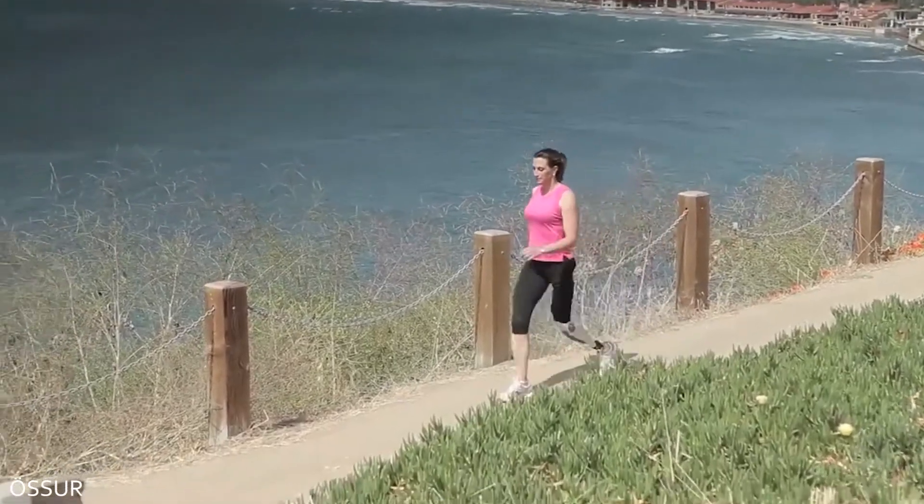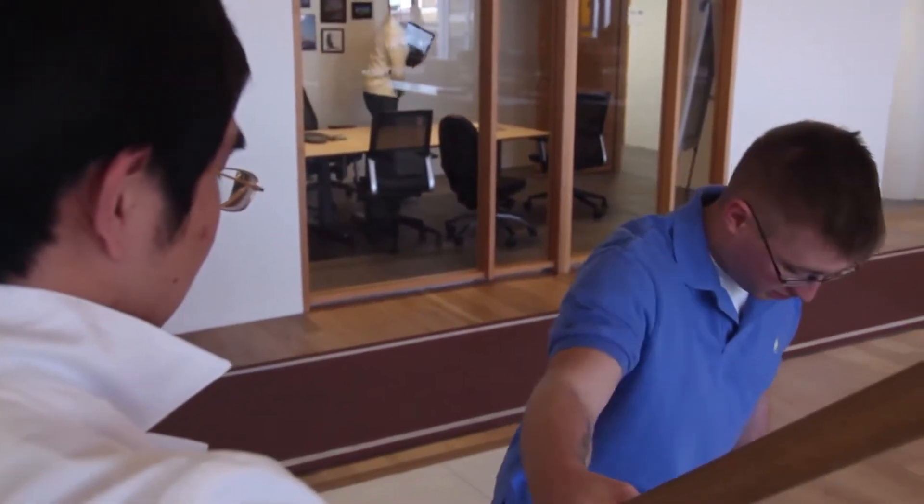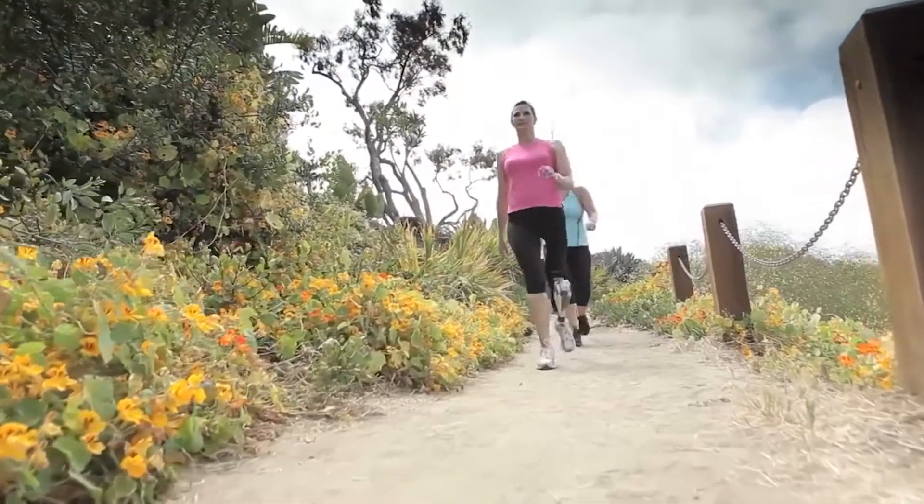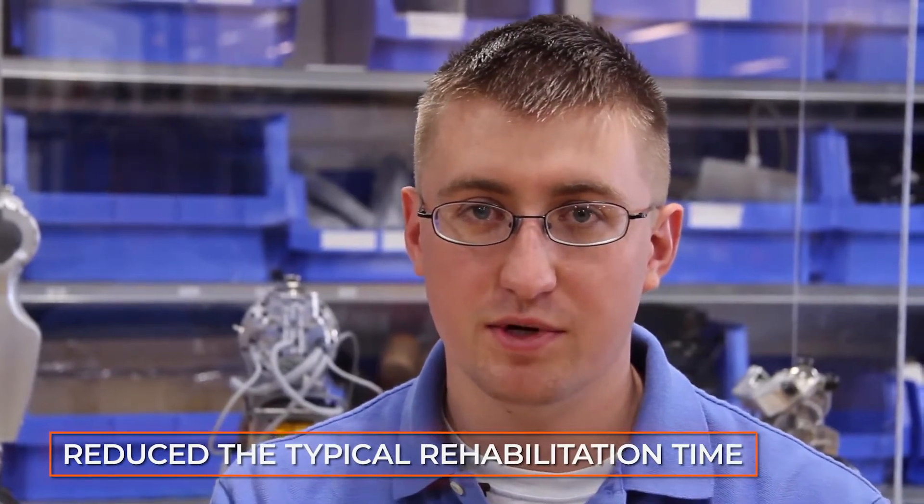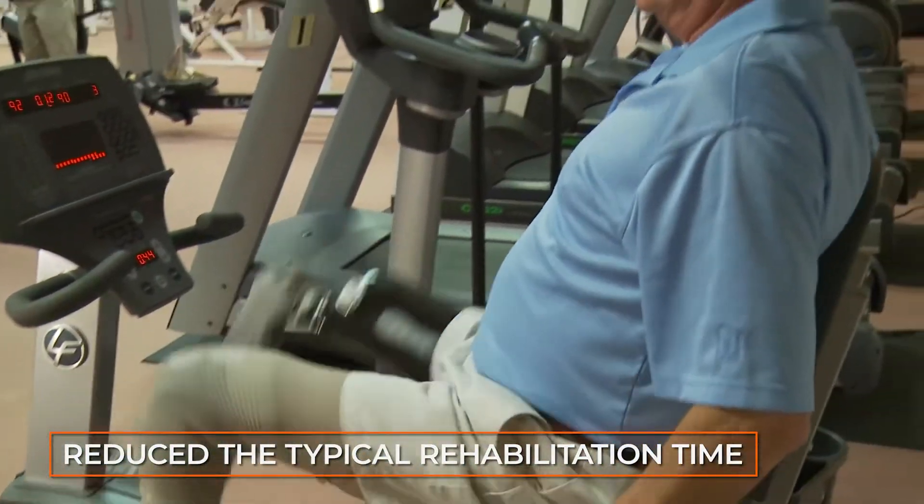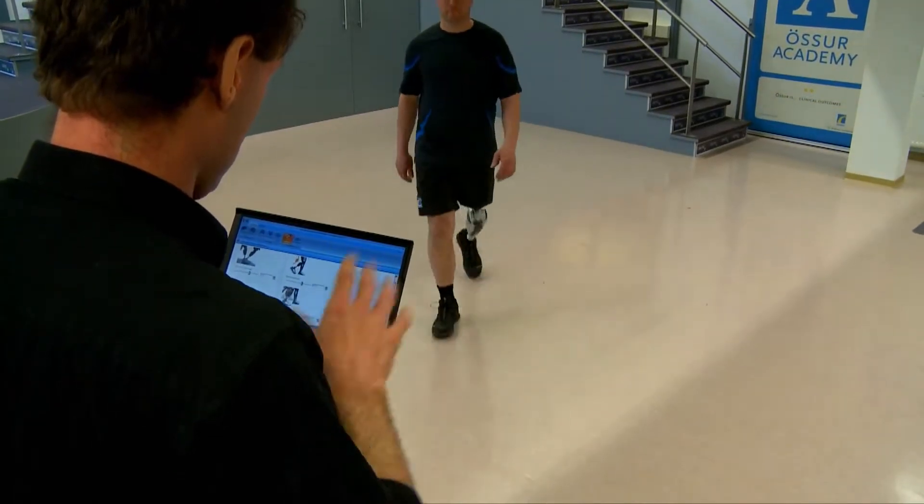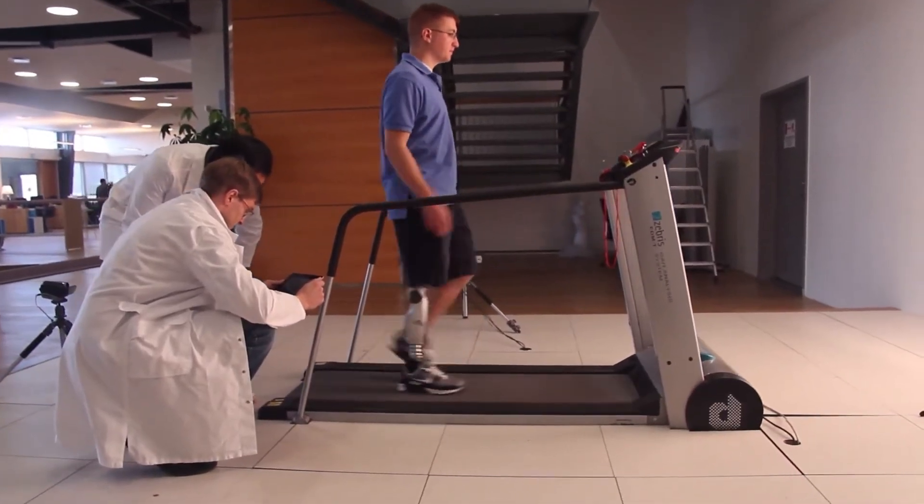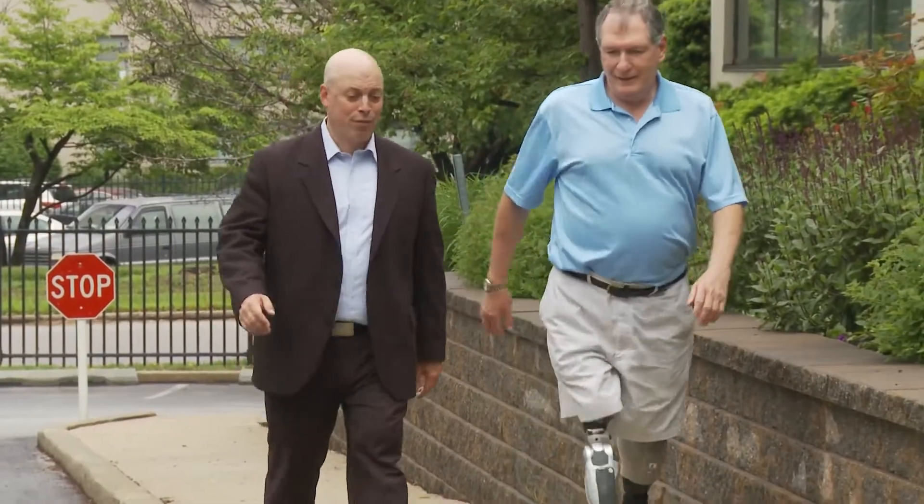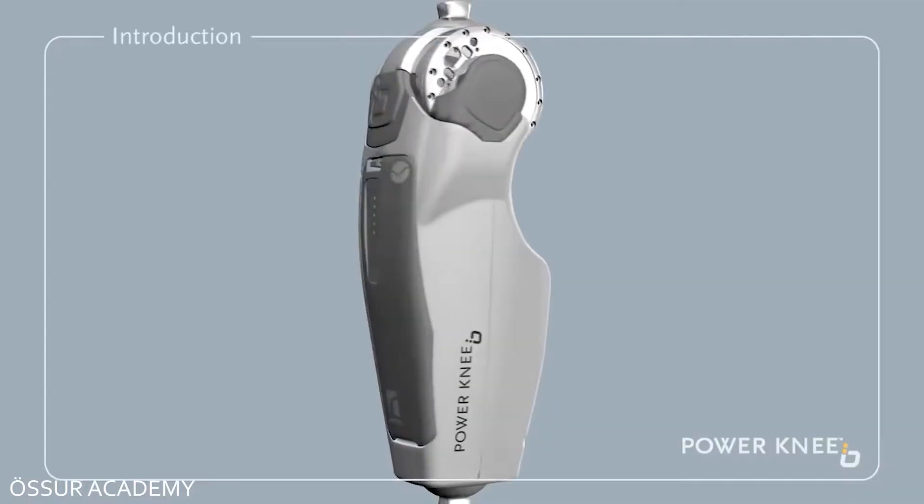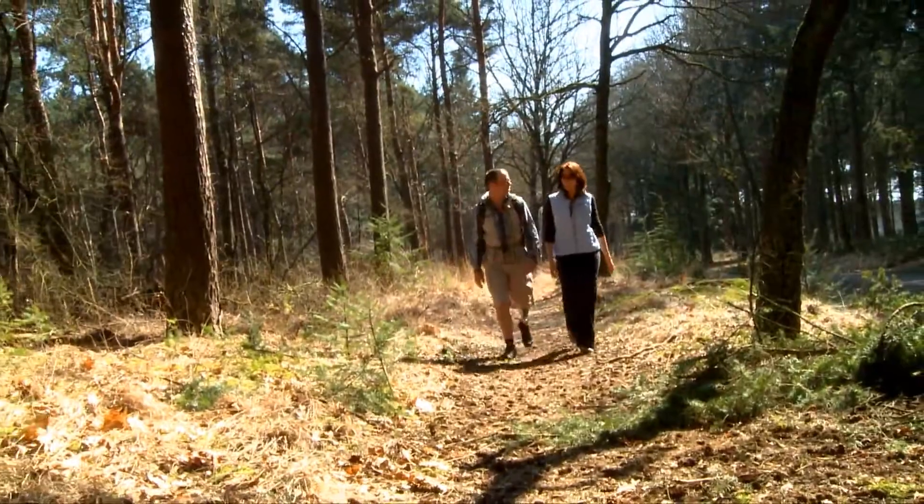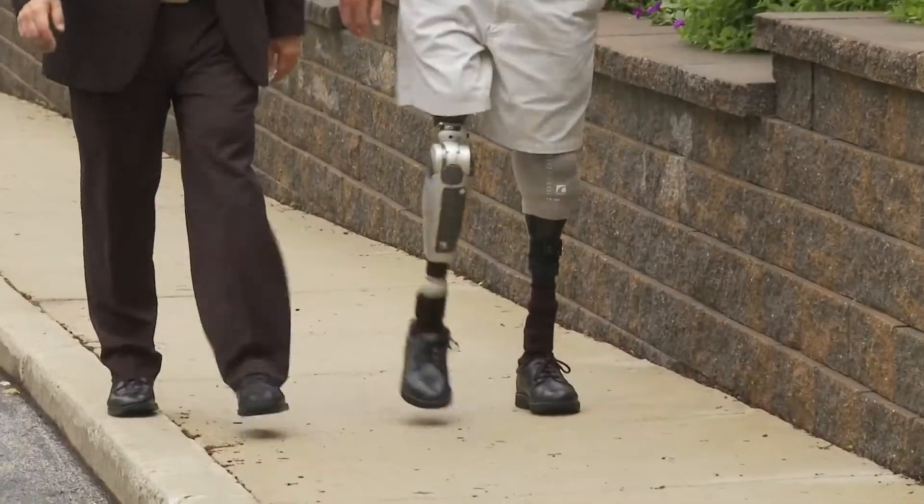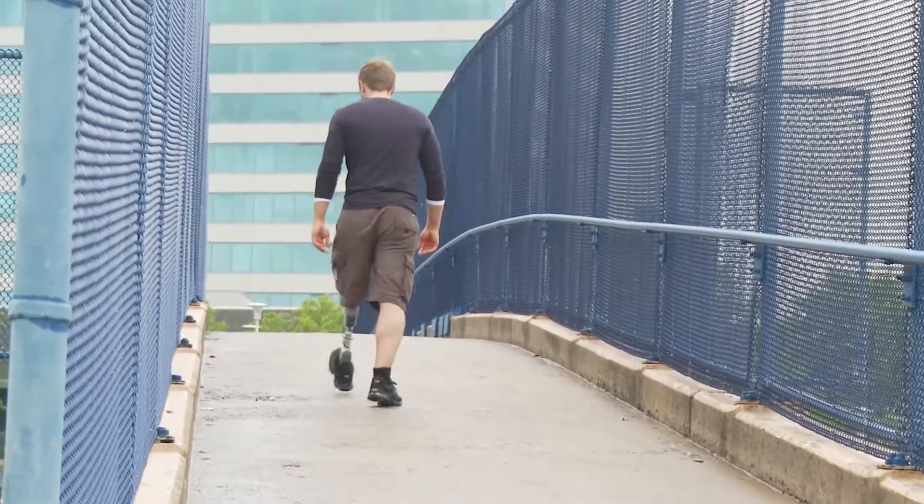Power Knee helps active flexion and extension while walking and facilitates symmetrical weight distribution, so you have a more natural gait. Active users have reported that the device restored their endurance and reduced the typical rehabilitation time required after surgery. The software also enables prosthetists and physical therapists to give users visual feedback during training. It logs and reports on user performance and prosthetic use for better reimbursement documentation. With the Power Knee, users can walk normally and more naturally because it essentially replicates the muscle activity needed to bend the legs. It can also learn the user's walking pattern and gait to be more efficient and comfortable.